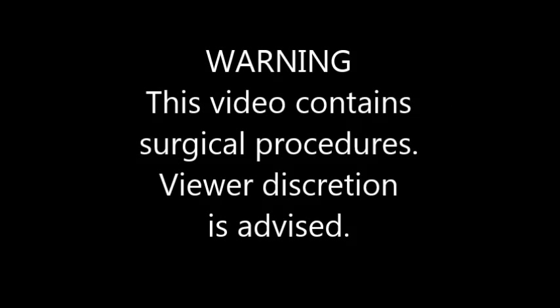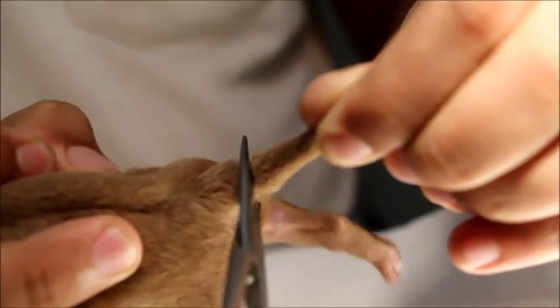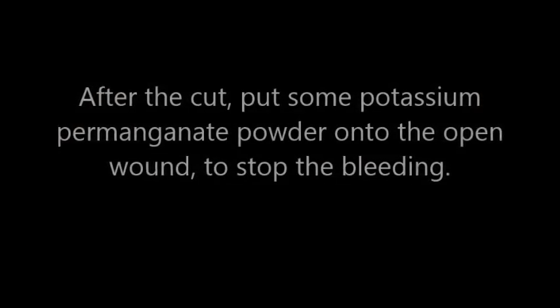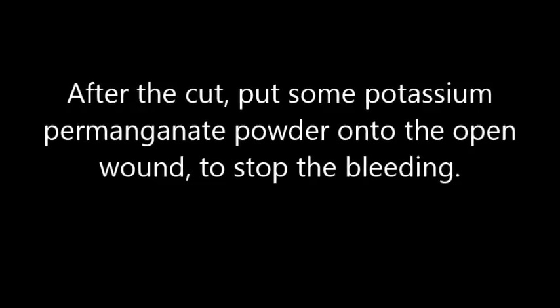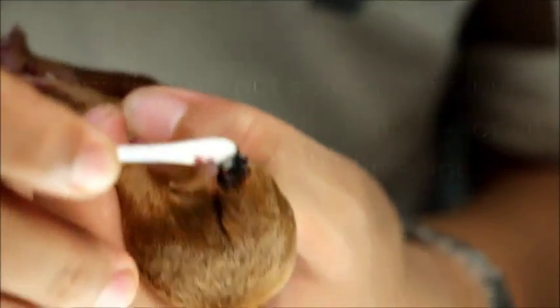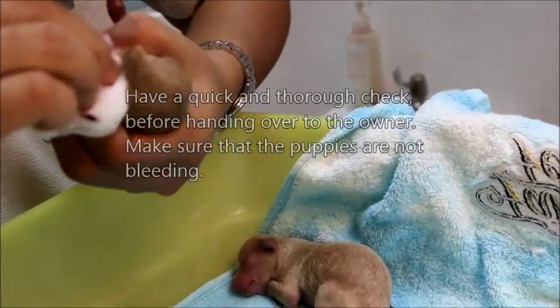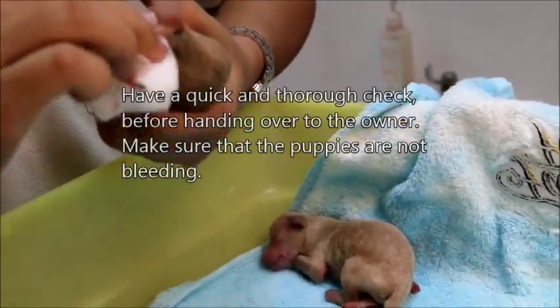Warning: this video contains surgical procedures. Angle the scissors at 45 degrees, tilt the scissors, push the skin towards the inner area and cut. After the cut, put some potassium permanganate powder onto the open wound to stop the bleeding. The powder aids in healing the wound. Have a quick and thorough check before handing over to the owner. Make sure that the puppies are not bleeding.